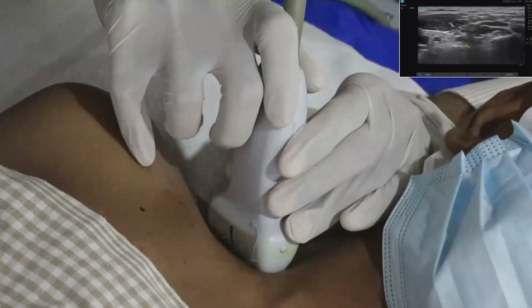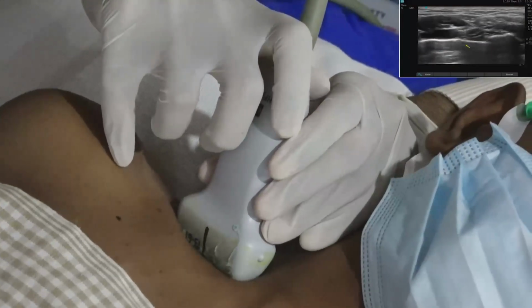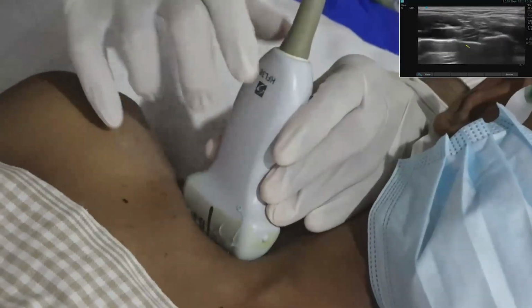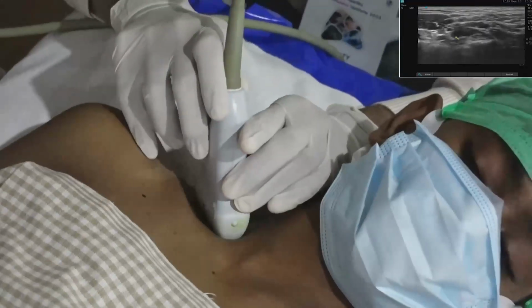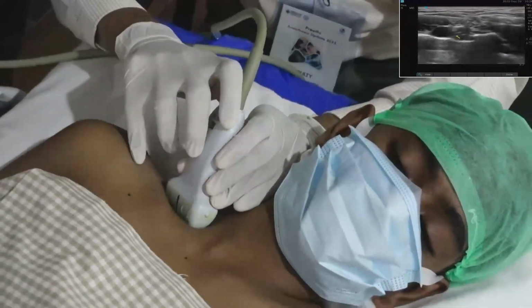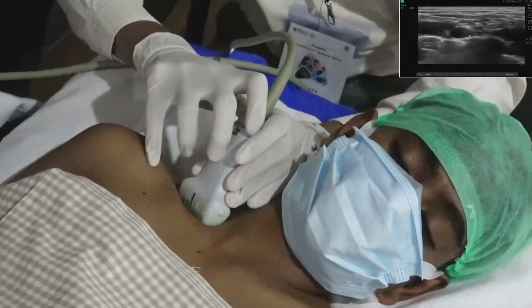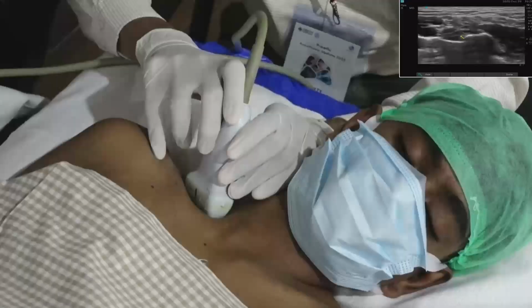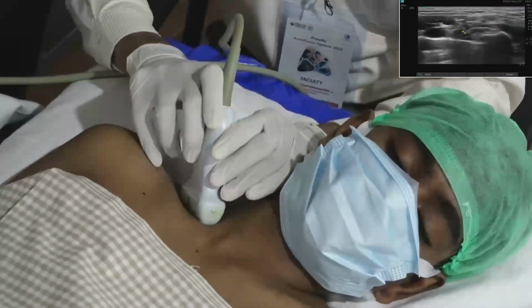Now I'll move further distal, like where we give the supraclavicular block. Some elements are coming out of the thoracic cavity. Identifying the T1 is possible in thin patients and around 40 to 60% of people.